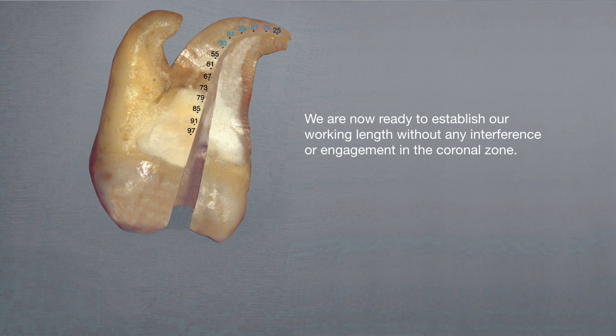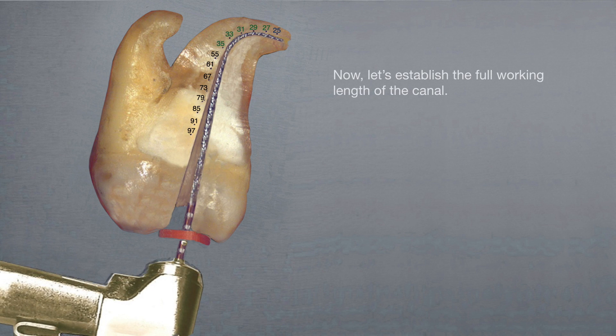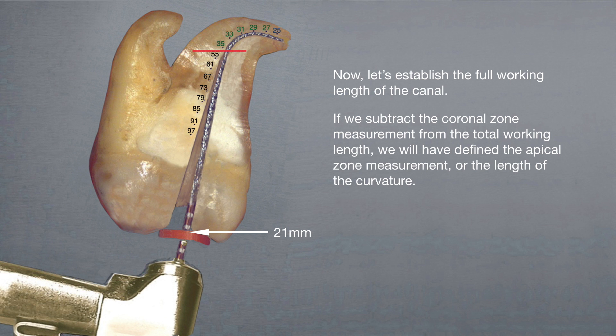We are now ready to establish our working length without any interference or engagement in the coronal zone. Now, let's establish the full working length of the canal. If we subtract the coronal zone measurement from the total working length, we will have defined the apical zone measurement, or the length of the curvature.